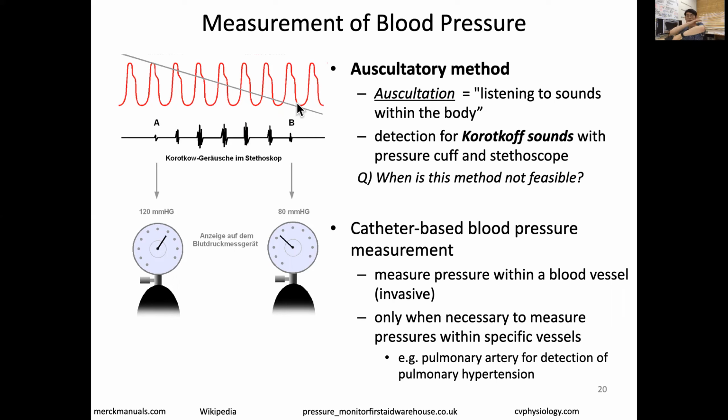Once the cuff pressure is lower than the actual arterial pressure, you don't hear a sound because you're not squeezing the artery anymore. The artery will flow smoothly, until the squeezing begins and there is a sound again. So by detecting this Korotkoff sound, from the higher beginning to the later point, you can read systolic pressure and diastolic pressure, using a pressure cuff and a stethoscope.